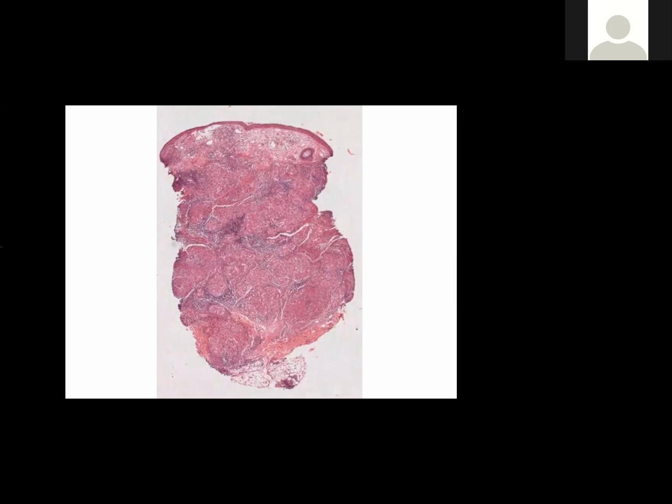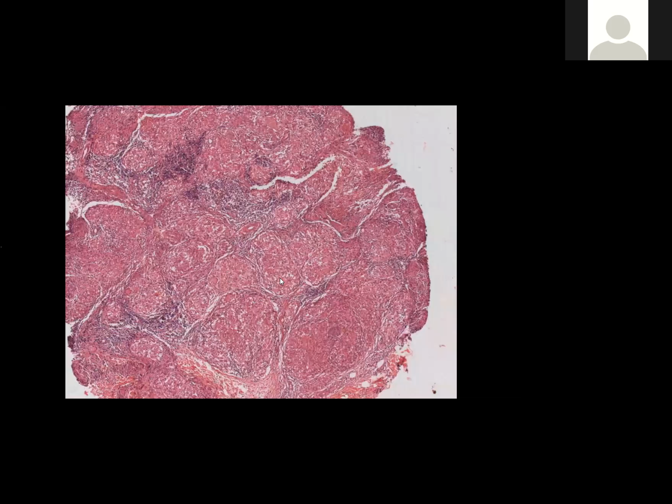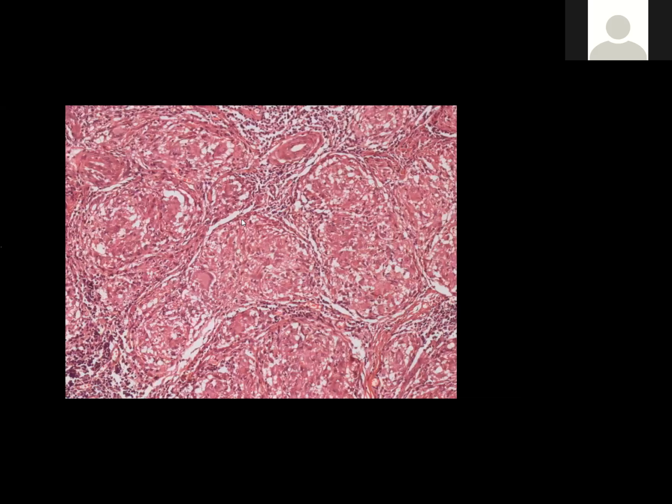And then he asked me to see one slide and said, "What do you think the slide is of?" And I looked at it and I saw that it was composed of a pandermal infiltrate. This infiltrate was composed of very circumscribed, monomorphic, monotonous collection, which was having paucity of lymphocytes at the periphery. There was only some sprinkling of the lymphocytes that can be seen at various levels. And clearly, these were all composed of epithelioid cell granulomas with multiple Langhans giant cells. So I told him that this is a clear cut case of cutaneous sarcoidosis.